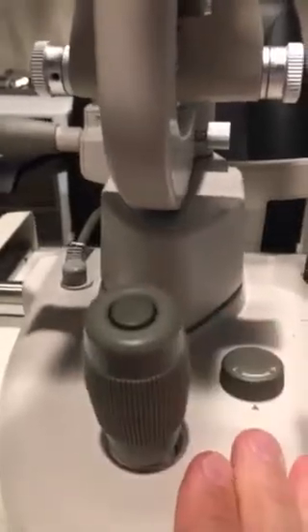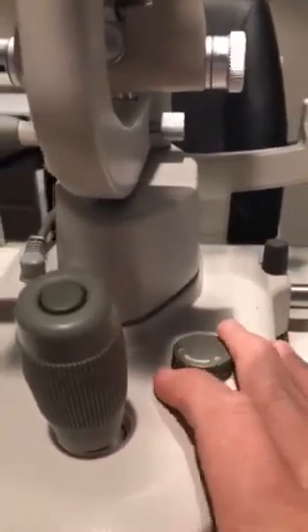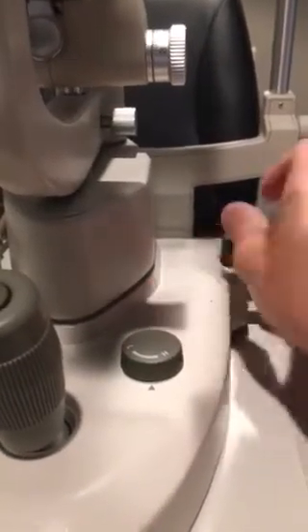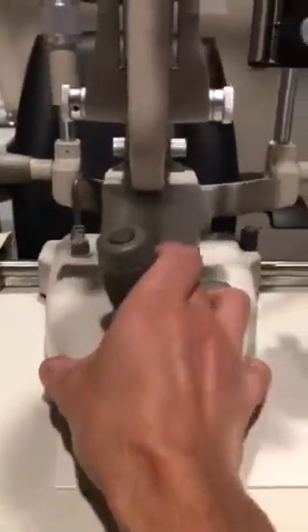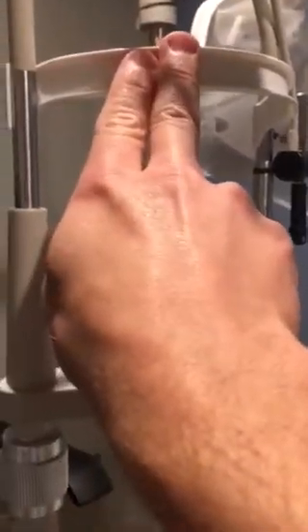We're going to control the slit lamp physically here with our joystick. Our light levels we can control here with the rheostat. There's a lock here on the side so if we're doing a procedure I can lock the lamp. I will unlock the lamp to show you how to move it — we can physically move this machine forwards and back. Always start pulled back all the way.